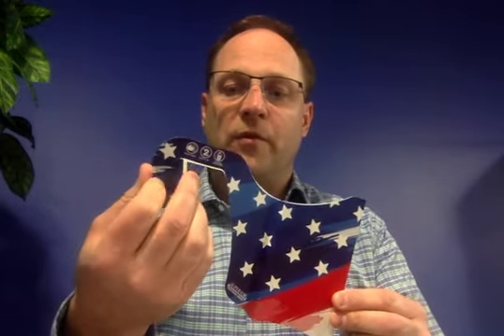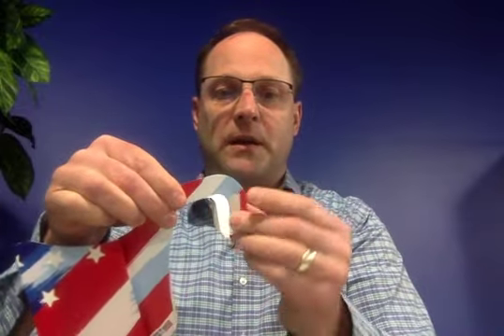This is the smallest size, so it's the closest from the nose to the ear. And then these little tabs that you see on the ear, they would stay intact. For a larger size head, this will stretch out naturally. And for a head like mine, which is a little bit larger, you can fold these little tabs back on the ears for a better fit. Okay? So I take that, and I can also put that on my face.